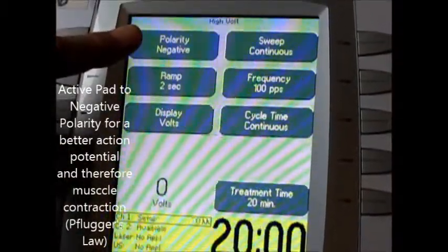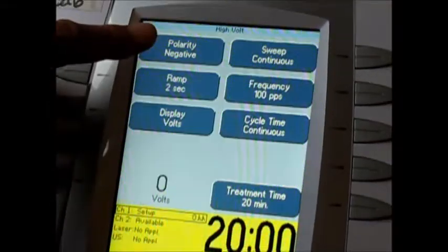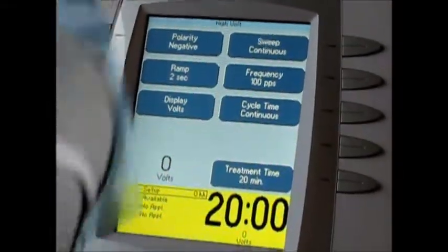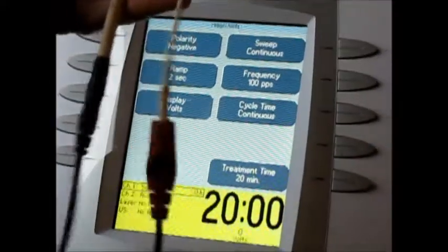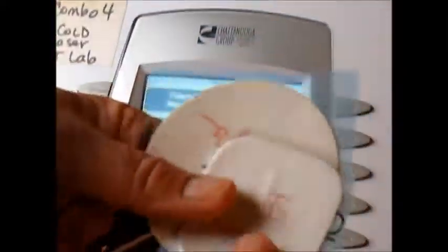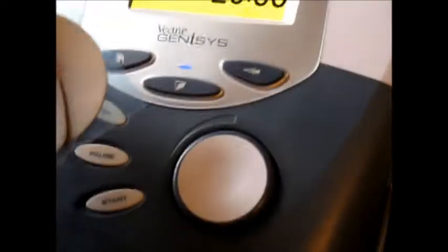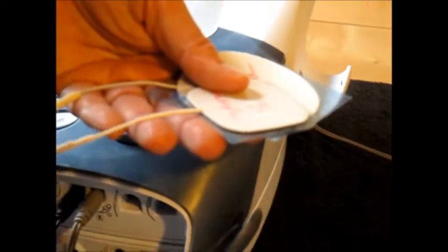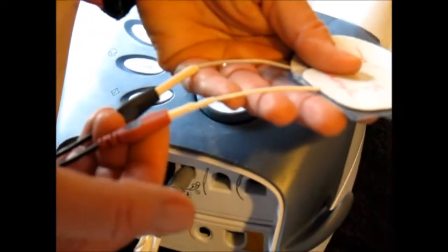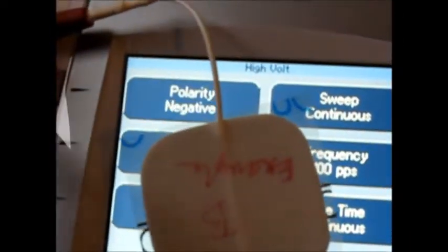The better action potential, the better the contraction on the active pad. The question is which of these two leads is the active pad? If you scroll down here you can see channel one is the black cord. On the tip of the black cord on this Chattanooga, I have a red and a black lead. The red lead on the Chattanooga is the active pad. This red lead right here is going to be polarity negative. If I switched it, now it's going to be polarity positive. So we'll go back to negative.